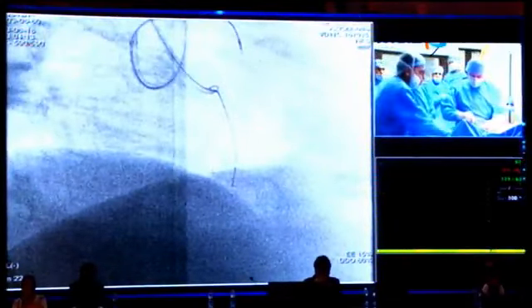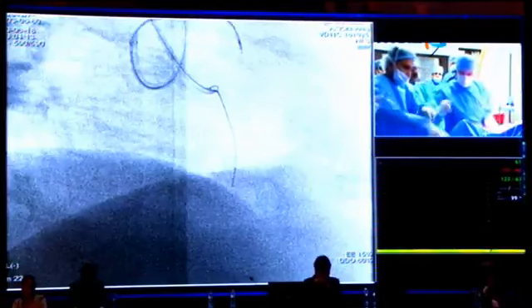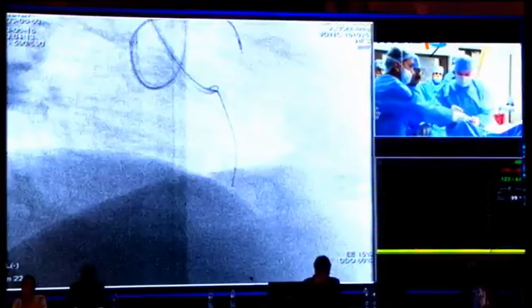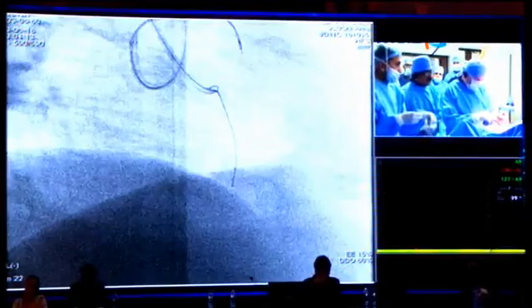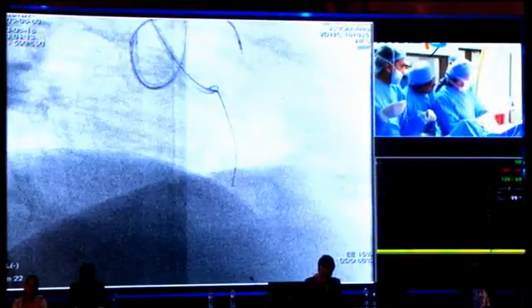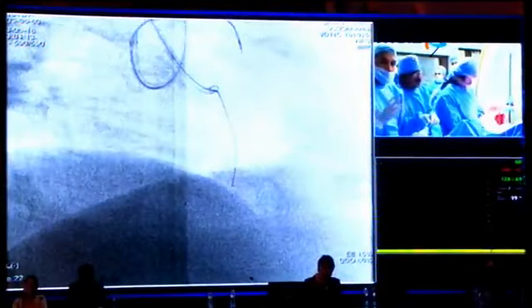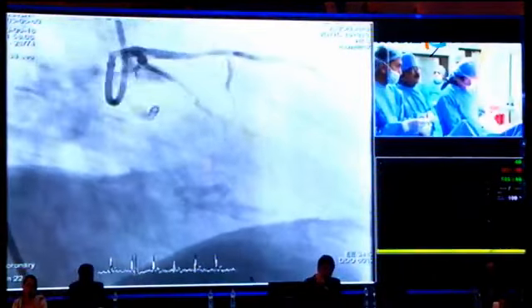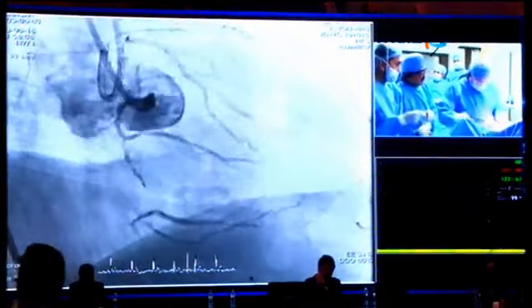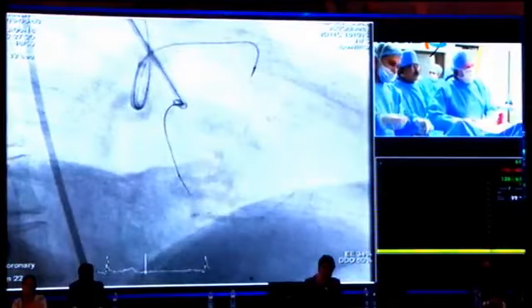Okay. Maybe I need a different bend. Take out the wire. Yeah, maybe a sharper, bigger bend, you need an angle. Sometimes the bend also straightens up, you know. So you see how it is looking now? You see it's almost straightened. It was too long in the vessel, the bend has already straightened and that's why we were not getting it. So now if we make an active bend, maybe it will go. Yeah, it should go there.